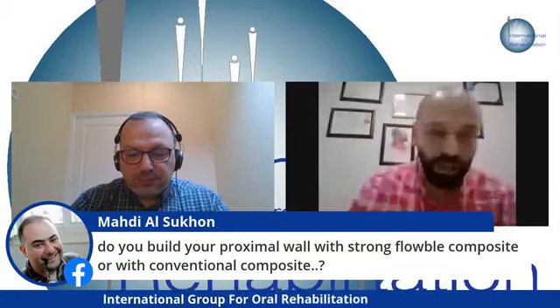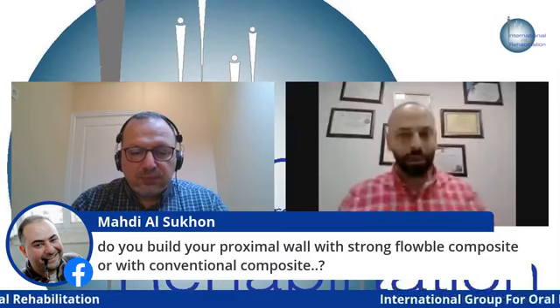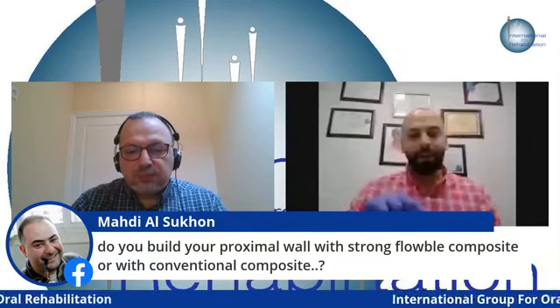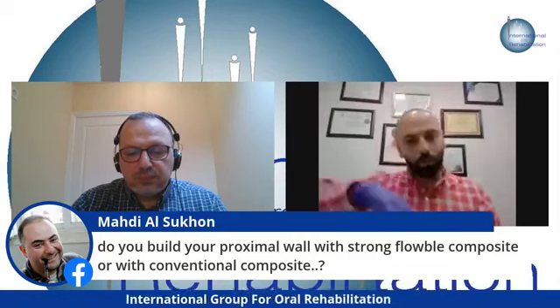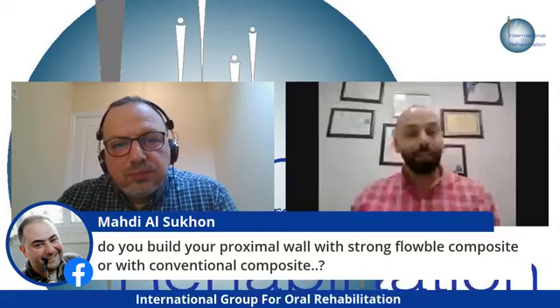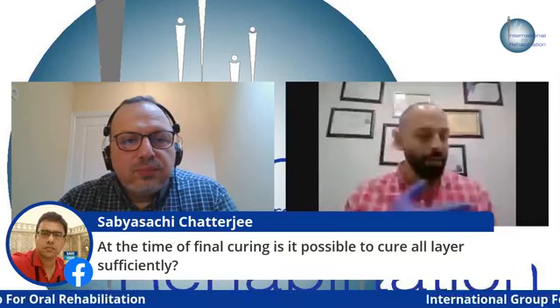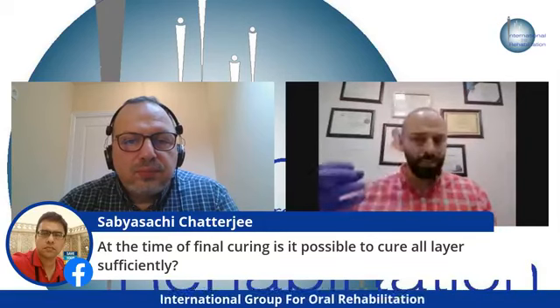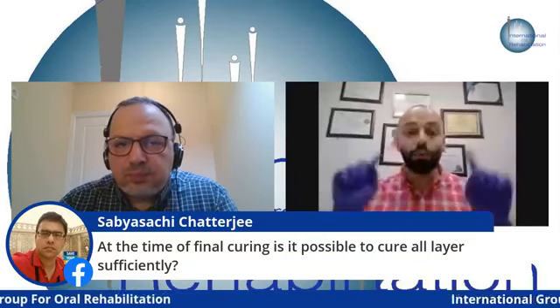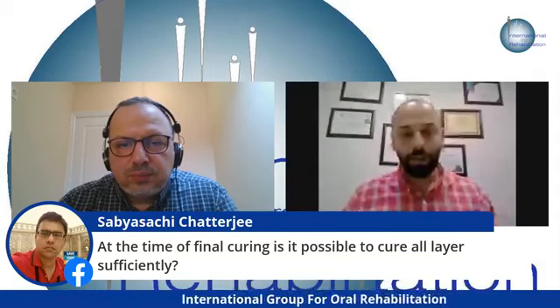Okay, I use both of them. I will show it to you in the practical part. I use the flowable composite but do not cure it, and then add the traditional composite, condensing it to the matrix system, to the wall, and after that do some shaping and then cure it. This will help us with the micro gaps that are normally created by using highly viscous normal composite. The normal composite is highly viscous, so it's not moving everywhere. So I use the low viscosity flowable composite at the margins, add the composite and condense it, and cure both together, not everything separately.